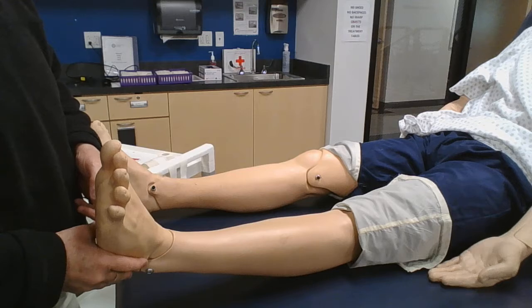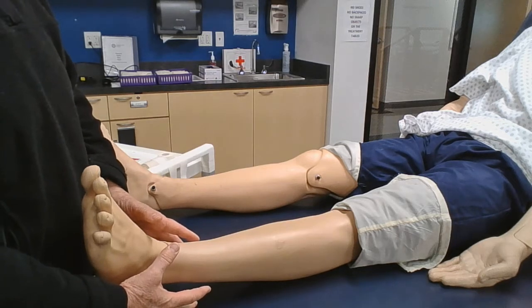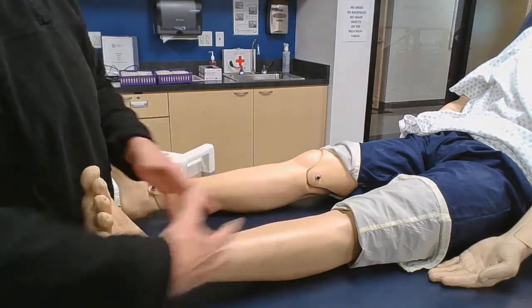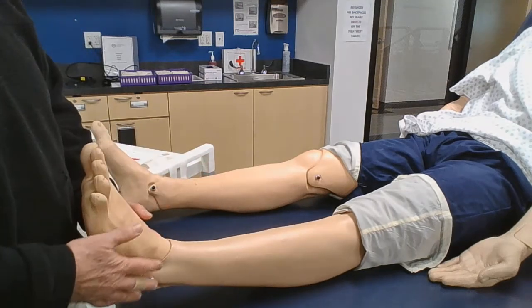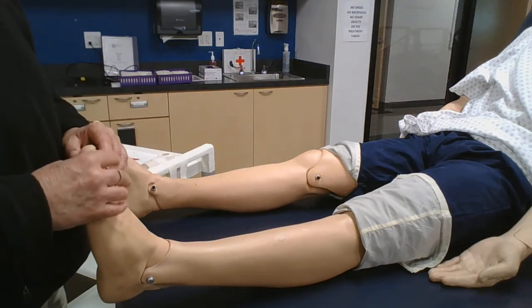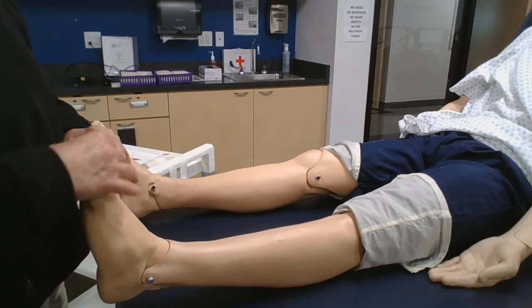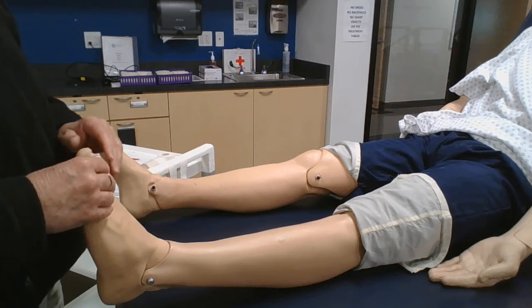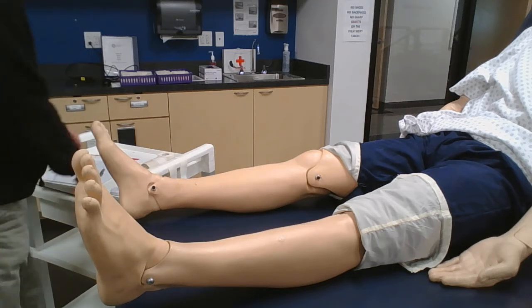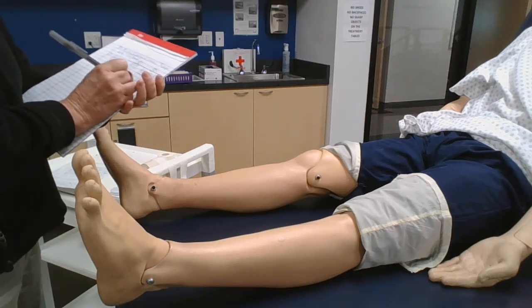You really want to know, does this patient have a pulse? Sometimes when people have really maximal edema, their pulses are affected by that. They can be compressed and all that kind of stuff. So you want to know that because now you're going to be putting more compression on. And you want to be making sure that the toes and everything. I'm also always looking at toes, I should have mentioned that when I was looking at observation, making sure that they're healthy vascularization here, nice and pink toes, not purple or blue and not white or super cold. And we'll talk about that after we wrap too. It's really important to check toes. Okay, so we did the pulses. What is a normal pulse? We put a 2+, 2+, 2+, 2+.